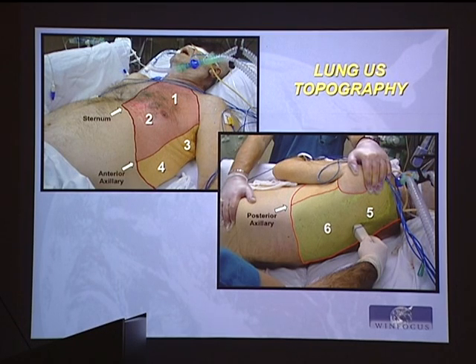But if my question is dyspnea, severe dyspnea could be a large pneumonia, pulmonary embolism, asthma, etc. So I will need at least 6 windows on the hemiclavicular line, on the anterior axillary line, on the posterior axillary line, at least 1, 2, 3, 4, 5, 6, because most of the causes of dyspnea will be large enough to be detected by this approach.